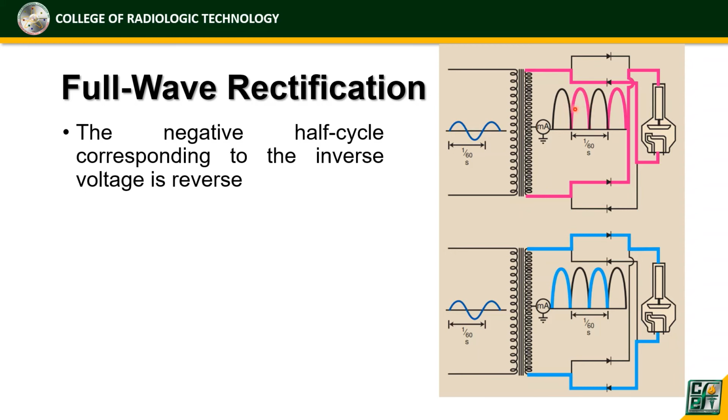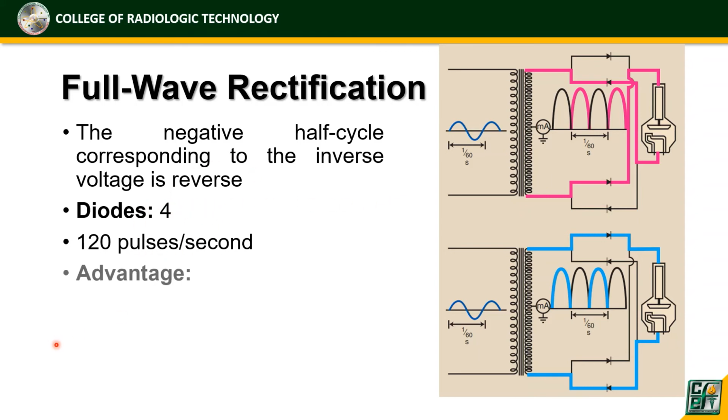Kaya siya ay instead na 60 pulses per second ay naging 120 pulses per second. Diodes na ginagamit niya ay 4 and advantage yung exposure time niya ay nare-reduce sa kalahati.